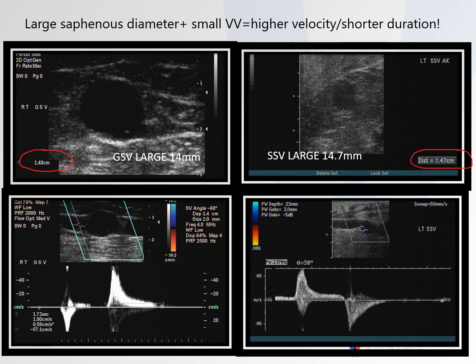Let's apply this to the real world. Here are a couple of patients I scanned. On the left you'll see the right great saphenous vein — it measures about 14 millimeters. The reflux time was about 1.7 seconds, not that long in duration for that size of vein; however, the velocities are very high even with the short duration. On the right, that's the small saphenous — almost 15 millimeters — so it too is large, and again we have high velocity with short duration of reflux.